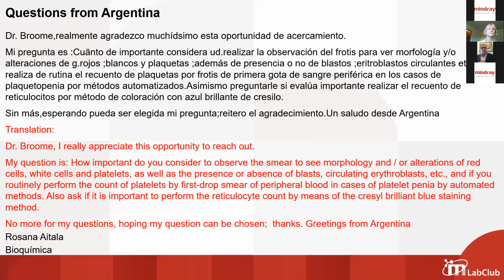Absolutely the same as you. I never heard that in cases with low red blood cell count, the MCV is not reliable. I never heard that, and I never saw any field correction from any company. As far as I know, all the main companies have a good, reliable MCV in cases of low red blood cells.